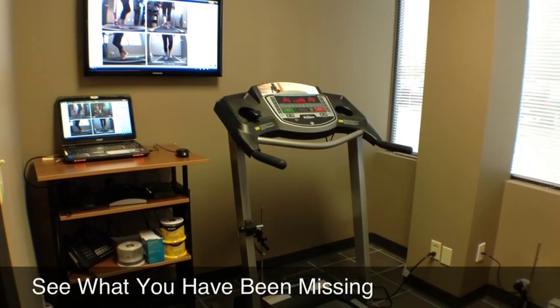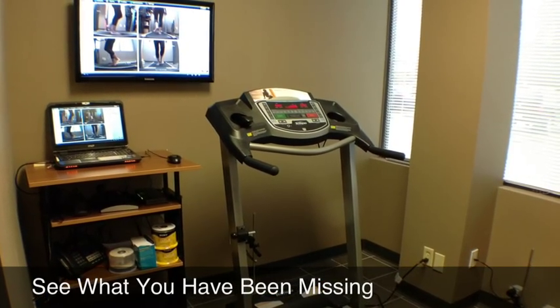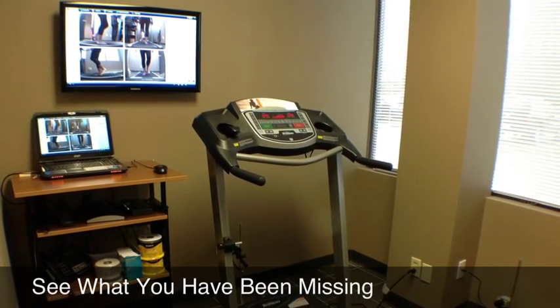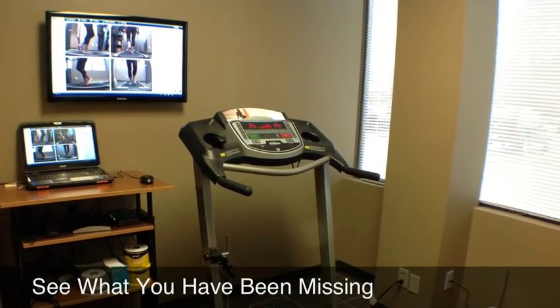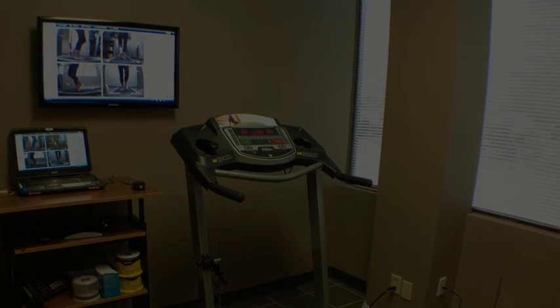Digital Video Gait Analysis has now given us the ability to show patients the details they were unable to otherwise see. It also enables them to make more informed decisions about their treatment options as it relates to their specific foot or lower leg dysfunction.